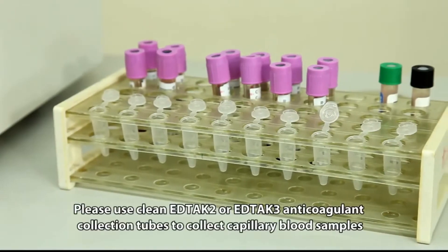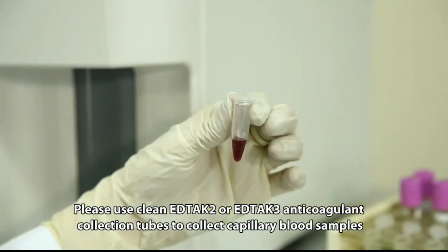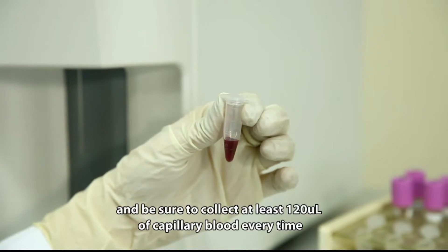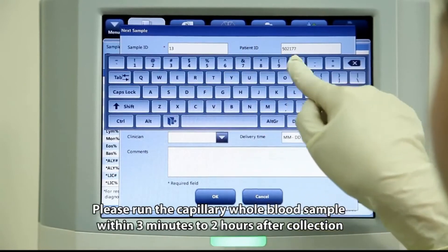Please use clean EDTA-K2 or EDTA-K3 anticoagulant collection tubes to collect capillary blood samples, and be sure to collect at least 120 microliters of capillary blood each time. Please run the capillary whole blood sample within 3 minutes to 2 hours after collection.